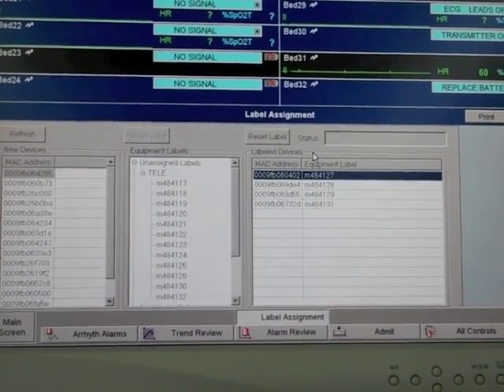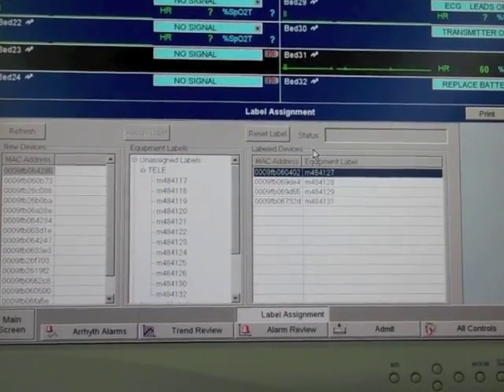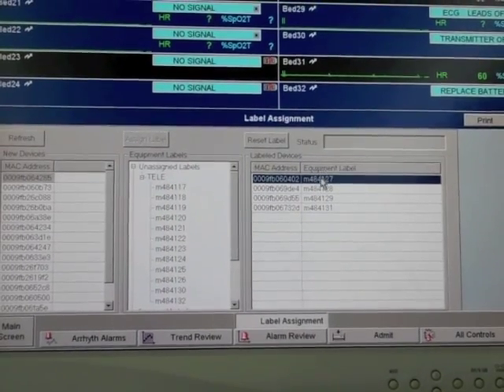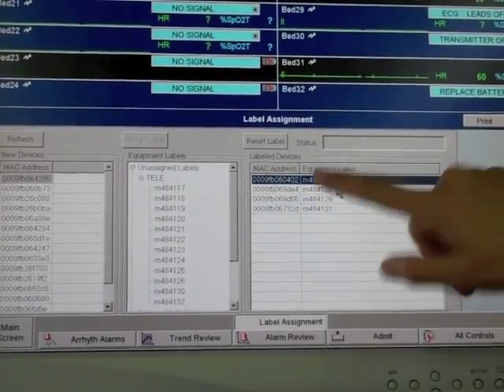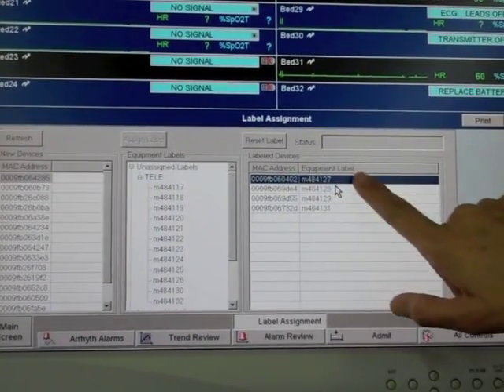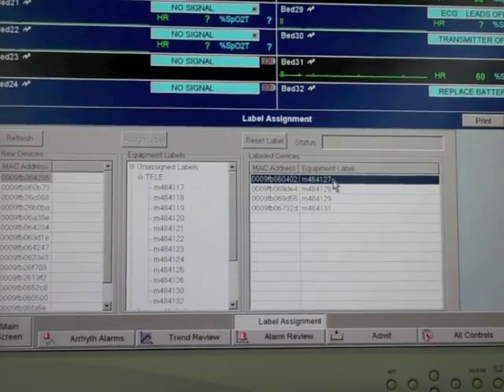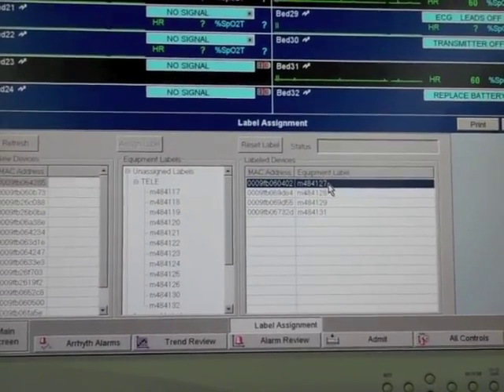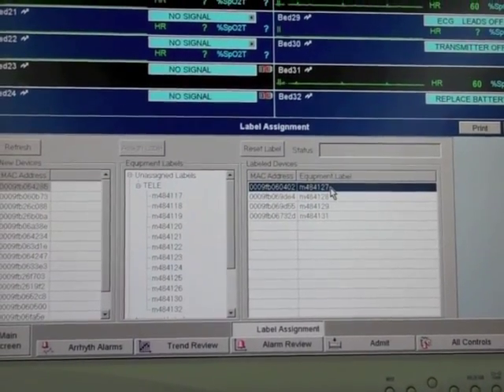After your unit is completed on the label assignment, you'll see it listed underneath your MAC addresses and it's ready to be viewed.